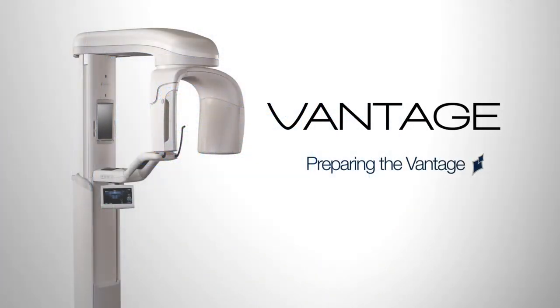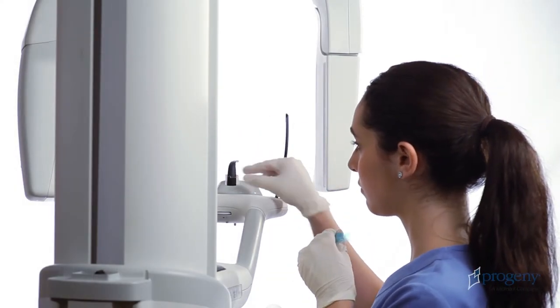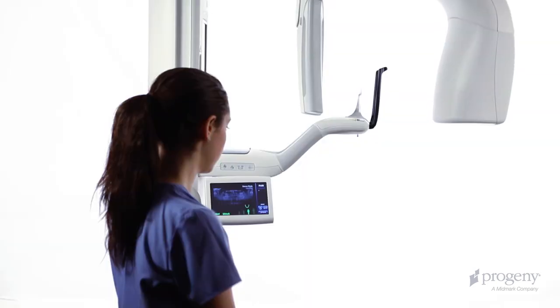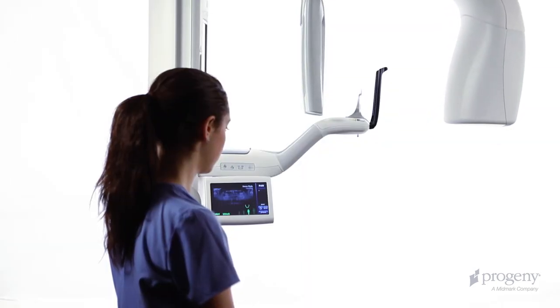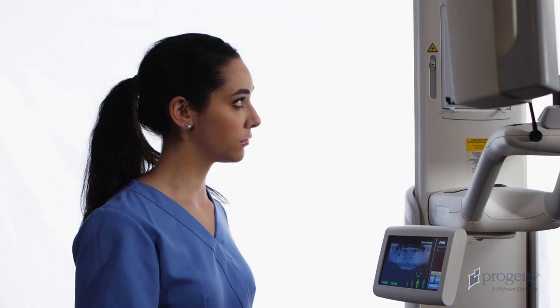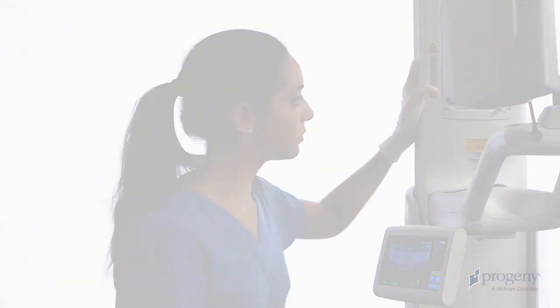Before introducing a patient for examination, we must prepare the system. If necessary, tap the cycle key on the Vantage touch to bring the overhead to the patient entry position. Then verify the yellow ready indicator. Place the Frankfurt plane laser in the lowest position.